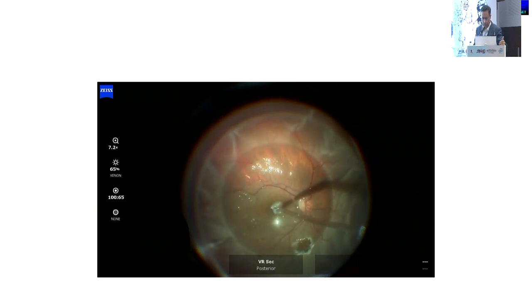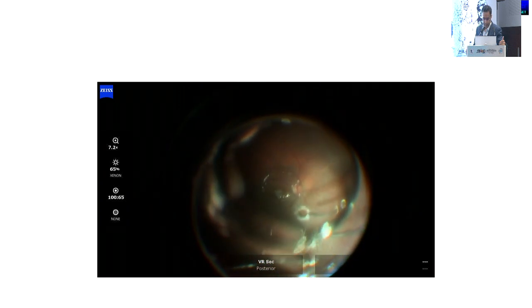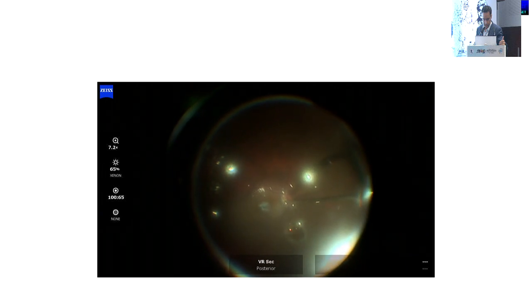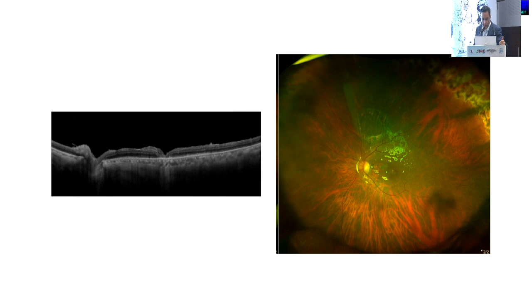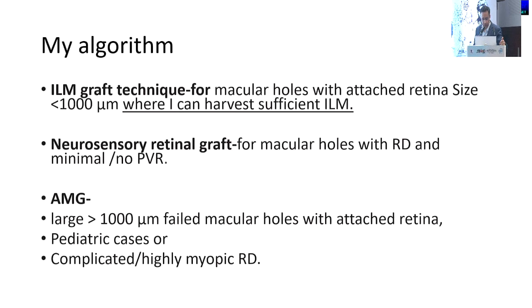Position over the hole, and here the finesse loop is very gentle and I feel it's atraumatic. Then we do a fluid-air exchange and put the oil. And this was post-operative. You can see it looks pretty nice. Graft seems to be integrated and patient is from hand movement to 6/60, retina is well attached.